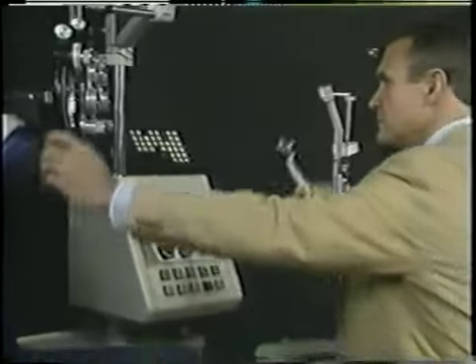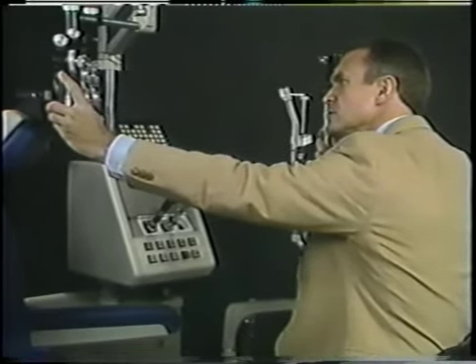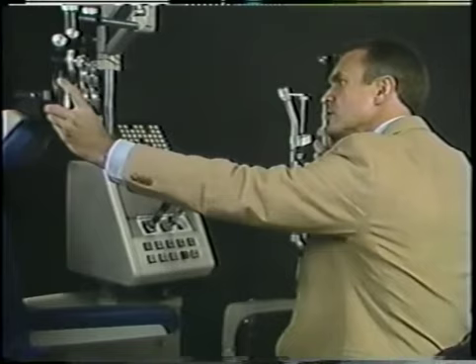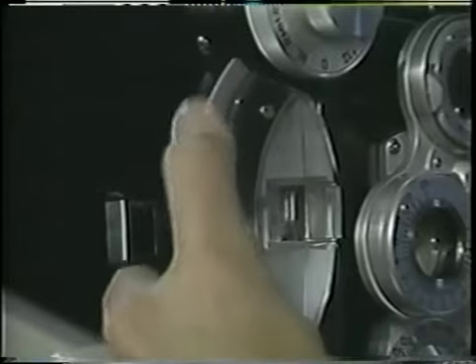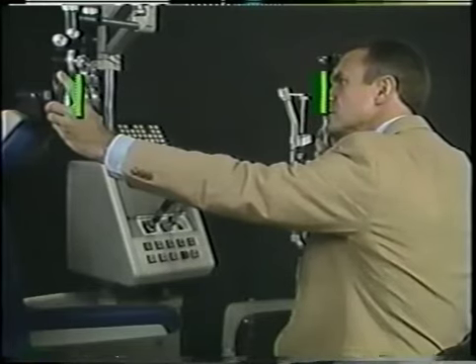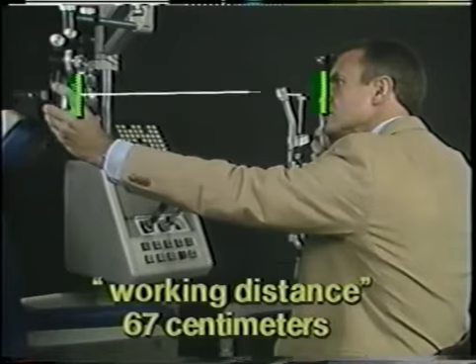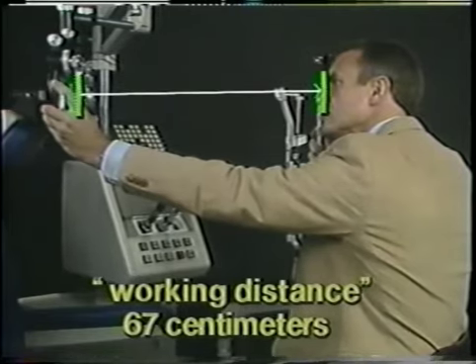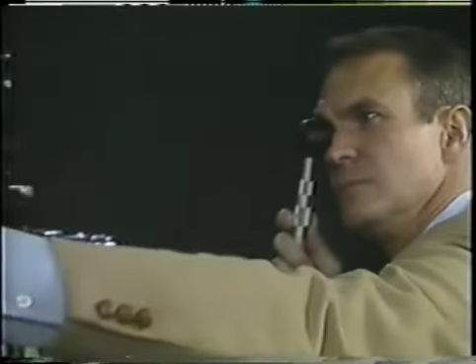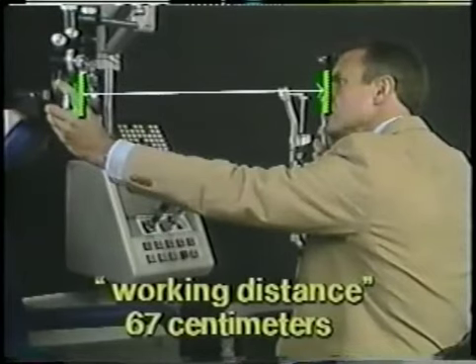To proceed with retinoscopy, you should sit a comfortable arm's length away, holding the retinoscope in one hand and sitting as far away as possible while still being able to adjust the controls on the phoropter. The distance between the phoropter and the retinoscope is called the working distance and is usually about 2/3 of a meter or 67 centimeters. During retinoscopy, you will sometimes move forward or backward, but should always finish up at the normal working distance of approximately 2/3 of a meter.